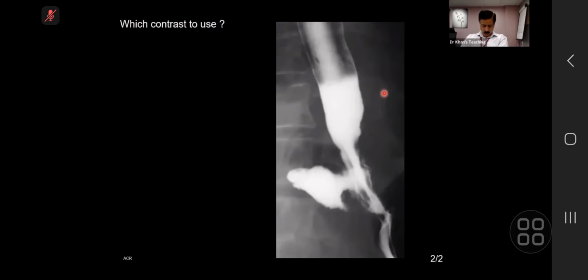I've seen quite a few. Where I work is a cardiothoracic center, so I've seen quite a few of them, particularly on call. This is a horrendous condition where a patient is absolutely fine and then has a bout of coughing and with this tear. So clinical history is very suggestive. CT is the correct answer. In the real world also you do a CT scan.